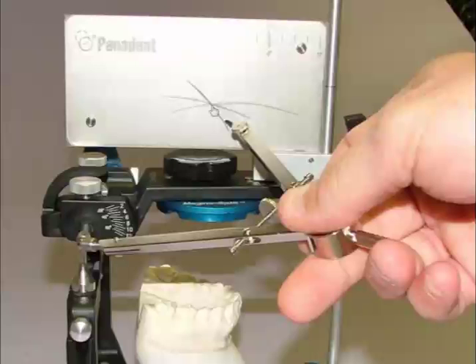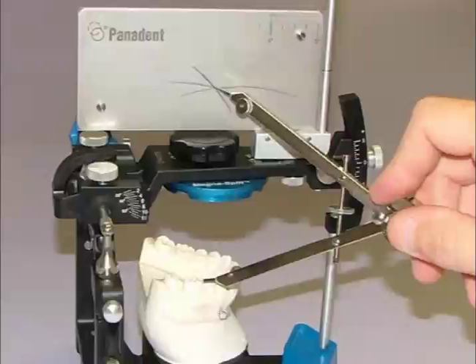We can now readjust the compass to that point and then sweep the compass across the occlusal surfaces of the teeth to evaluate the plane of occlusion or the curve of Spee.